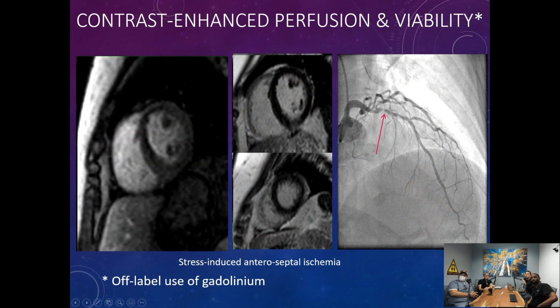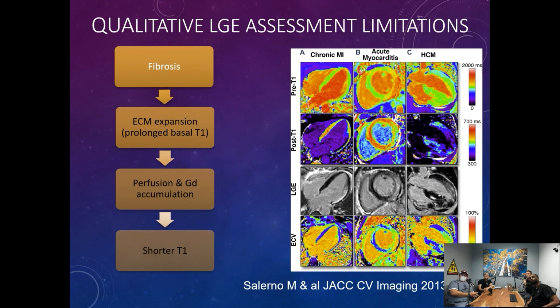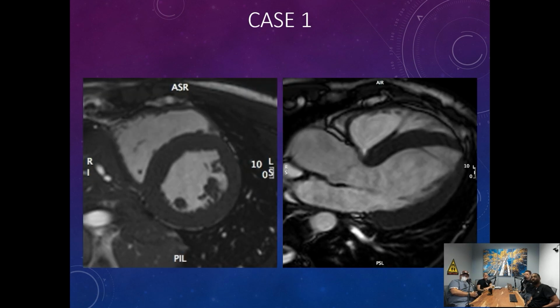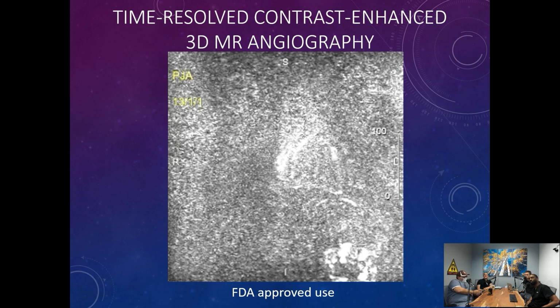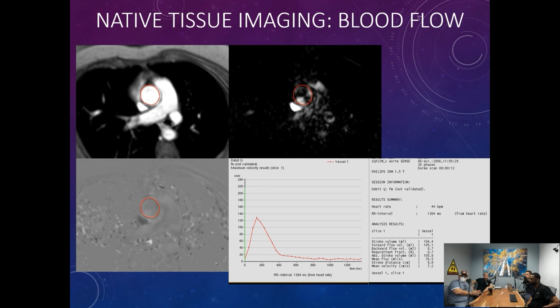While you're pulling it up, Dr. Jokerst, when you see these velocity flows and you're looking for aliasing and whatnot, what else is it that you're looking for? What tools do you use to evaluate that? So when we're talking about phase contrast imaging in general, basically that is the color Doppler / pulse Doppler equivalent from echo. So you've got phase contrast imaging.